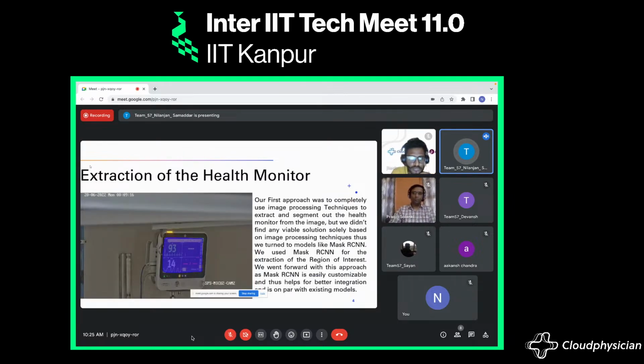For the extraction of the health monitor, our first approach was to solely use image processing techniques to segment out the screen of the health monitor, so as to filter out the necessary information displayed on the screen. But we soon realized that this was not working on edge cases wherein the image had a lookalike shape of the monitor and had some numbers.